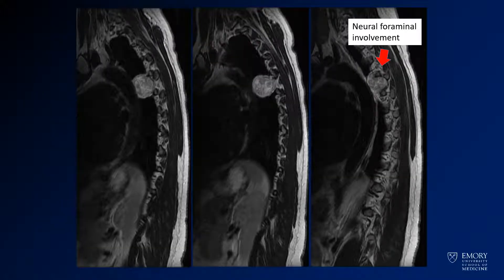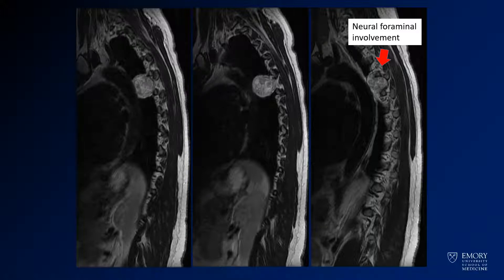Here you see there's some involvement of the neural foramen — expansion of the neural foramen. So on that CT, that neural foramen was larger than the adjacent neural foramen, kind of smoothly remodeled.